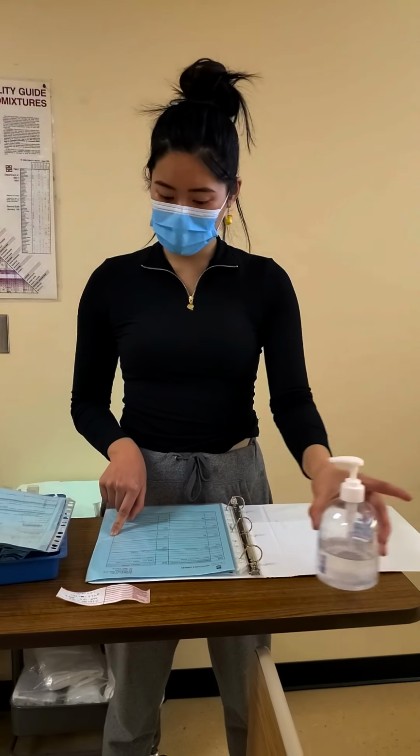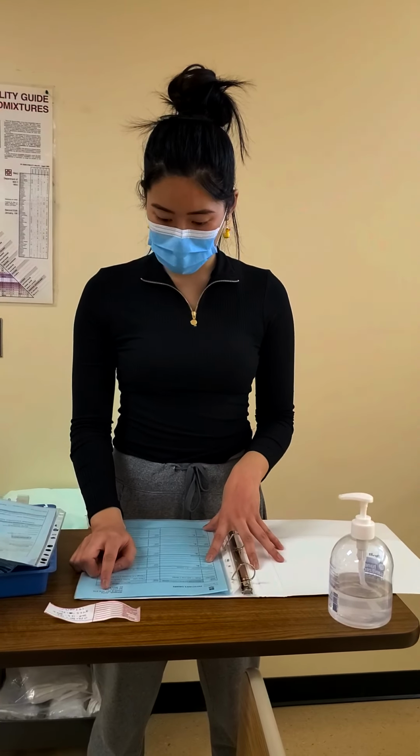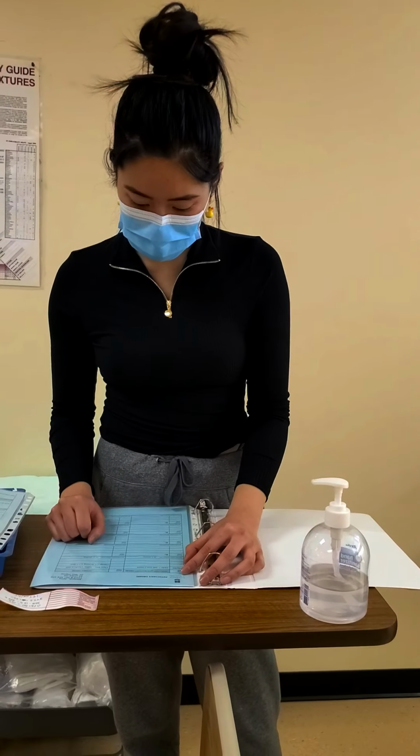My name is Julian. Today we are administering blood. I have the physician's order open here, and our patient, Atrique Jerry, VIN number 261-824-375. And so we're going to take a look at the order. So it's for packed red blood cells, and it's 1 unit over 2 hours.